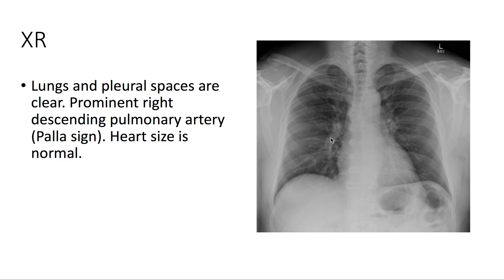On x-ray, the lungs and pleural spaces, as well as the heart, are normal. However, we can appreciate a prominent right descending pulmonary artery, or Palla's sign.